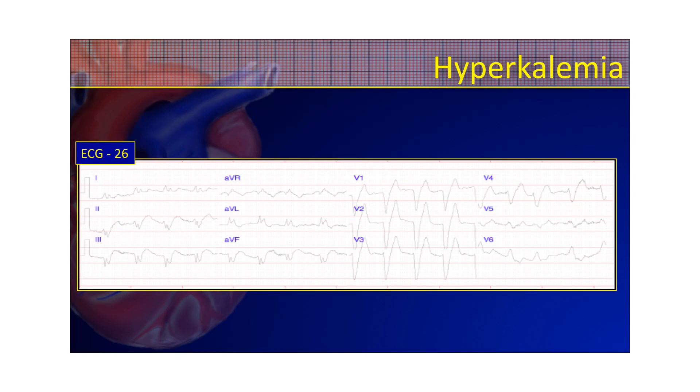Here's another 12-lead EKG that appears to have a sine wave pattern. Again, this kind of fits your left bundle branch block pattern. You have a supraventricular wide rhythm, and you have a negative QRS complex in V1. But you also have a straight line from the nadir to the peak of the T-wave and a patient with renal failure that hasn't had dialysis. So use the patient along with the 12-lead to make your diagnosis. Great thing about EKGs is every EKG comes with a patient. Make sure you assess your patient and don't just assess the monitor.